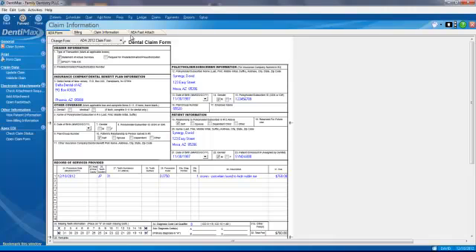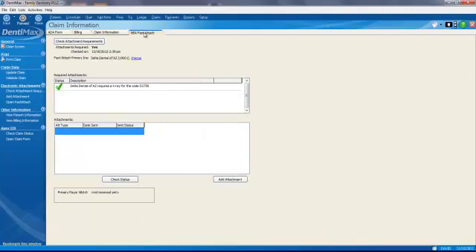And we have a new tab called NEA Fast Attach. We'll go ahead and click on that, and it says that yes, in fact, an attachment was required.